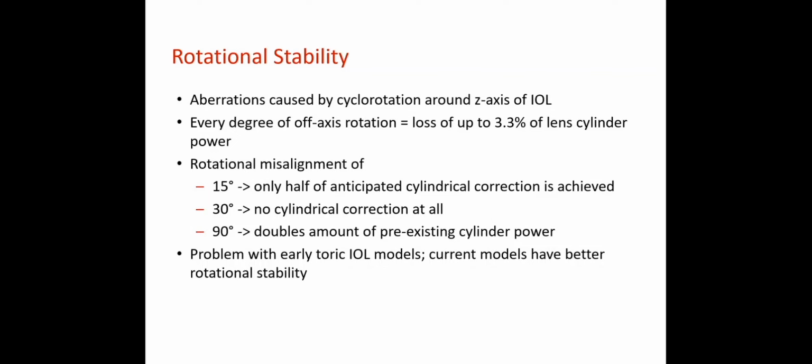For example, SRK/T TK, and there's a Barrett Universal 2 TK formula as well. So you need to pick the right formula, not just the regular Barrett formula or the regular SRK/T.